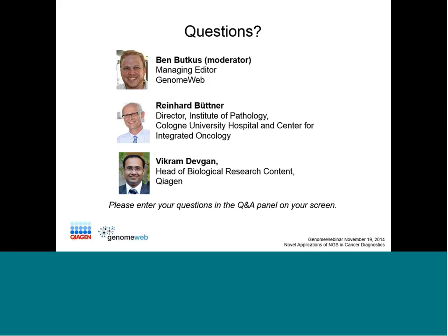Can I add one sentence to this? Please go ahead. If you see that you lose, for example, through the purification step, a lot of DNA, the most likely reason is there's a lot of degradation. The typical reason is overfixation or heavy underfixation, and the tumor is not fixed well and it degrades because all the enzymes still work. And then you, as a pathologist, should talk to the primary people that handle the tissue. I think you need to improve the tissue fixation. That's a very important step.